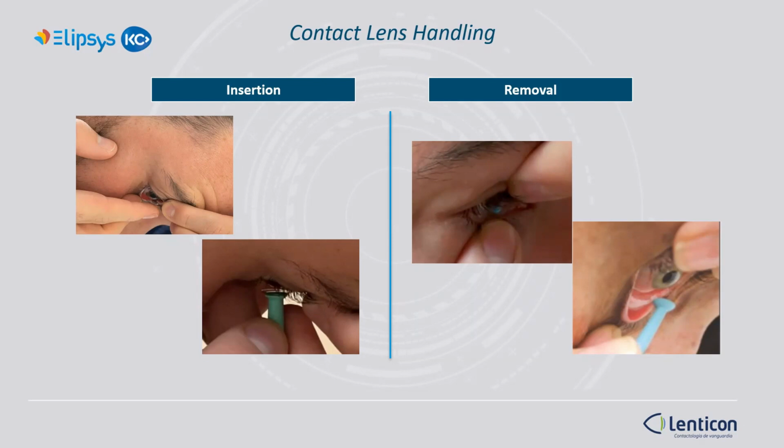Ask your patient to thoroughly wash their hands with soap and water, and to dry their hands with a lint-free towel to avoid transferring debris to the lens. Rinse the lens with a recommended cleaning solution to remove any debris. Use the index finger to position the lens, and with the non-dominant hand, use the middle finger to hold the upper eyelid firmly open, avoiding any blink during insertion.